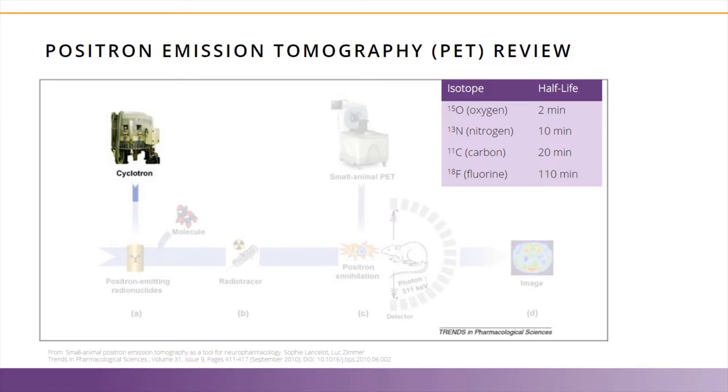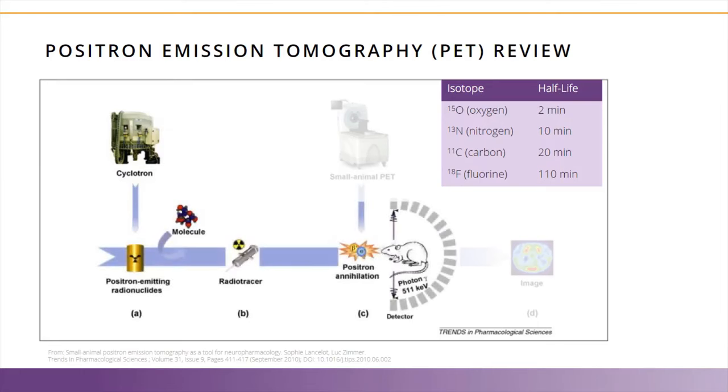The same cyclotron is used to manufacture radioisotopes for clinical and preclinical imaging applications, as there is really no difference between them. Chemists at these facilities may be able to make custom radioisotopes or radiotracers as desired by the specific research application. These may include small molecules, antibodies, and other compounds which may be of interest to the researchers across a wide variety of applications, as we will discuss shortly.